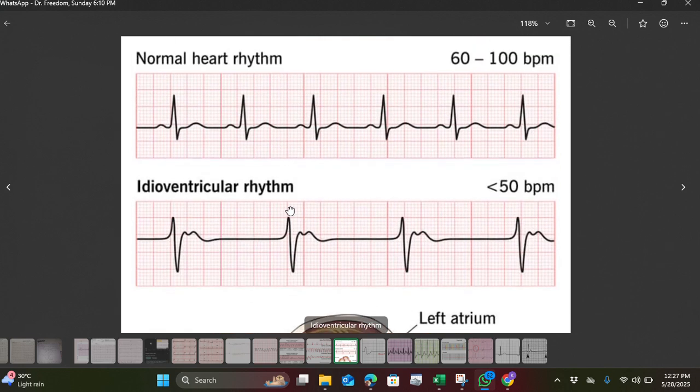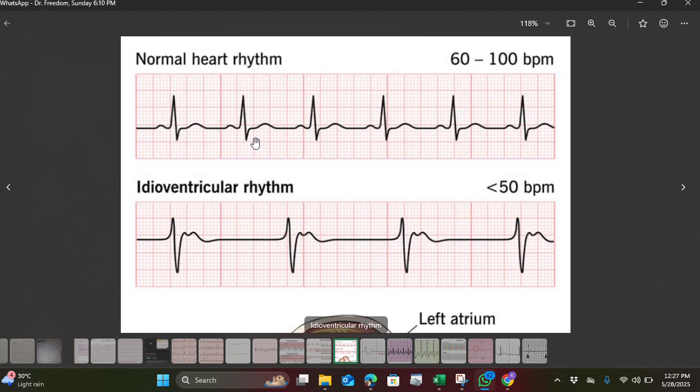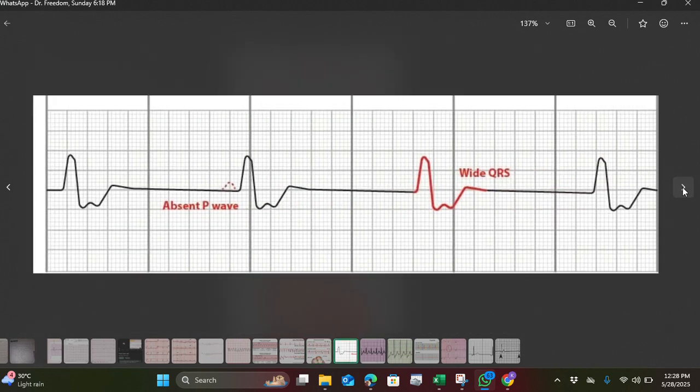See now, this is a normal rhythm. See your T, very fine. The children are eating, everybody is growing. But here now, something is wrong with this T, is it M or W shape that is there? Let me show you another one. I think, is it? Yeah.